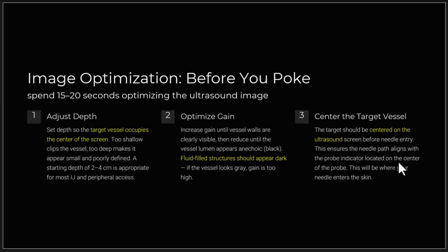Also very important is image optimization. So you want to spend 15 to 20 seconds really optimizing the ultrasound image on your screen. You'll want to adjust the depth so that the target vessel occupies the center of the screen. You don't want it too shallow or too deep.